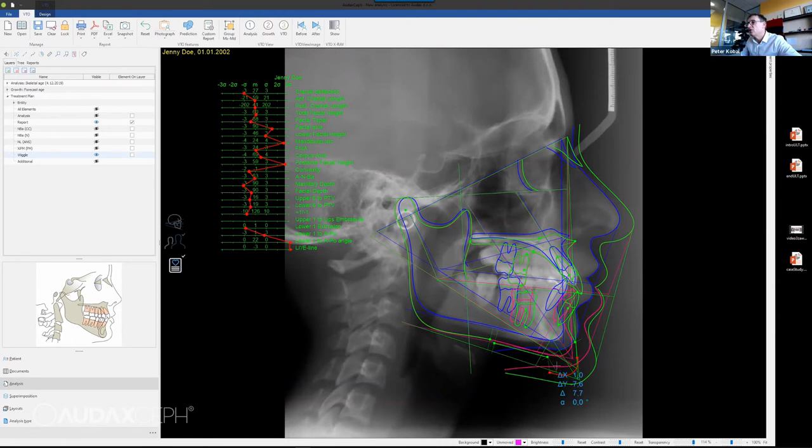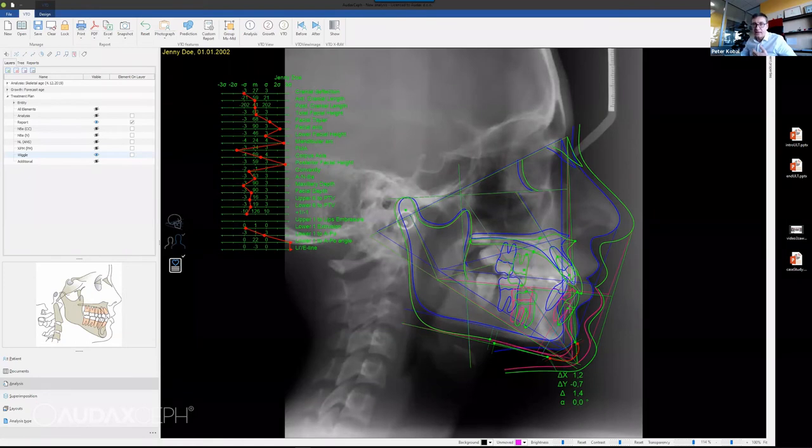If I change the position of the tissue, some measurements which depend on the position of the tissue will change. You can also create your own measurements like this, so delta boxes with wiggle charts, so that you will be able to customize your VTO goal. We'll do that in a separate webinar. We'll have that, I think, in the middle of January.